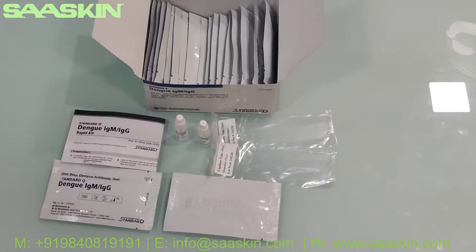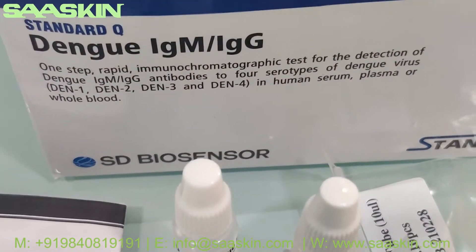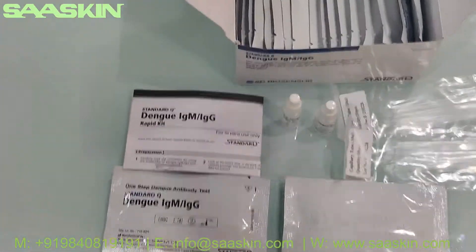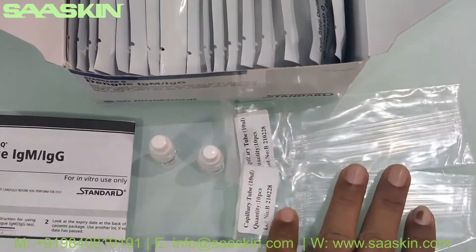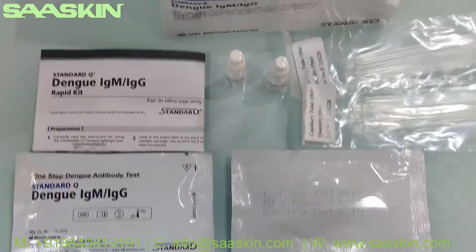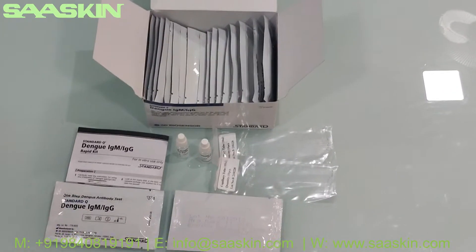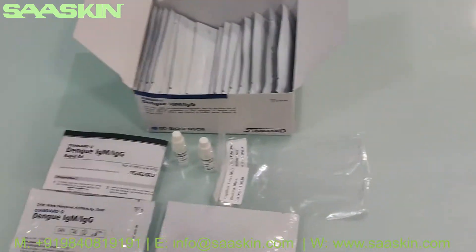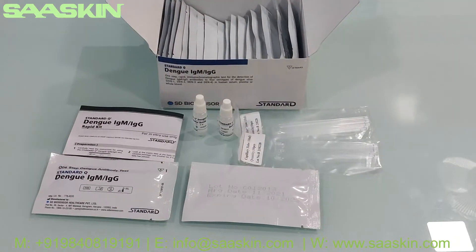Quickly to summarize: the Standard Q Dengue IgM IgG antibody test kit 20-test box contains one instruction for use manual, 20 specimen transfer devices, two bottles of buffer liquid, and 20 test cassettes. This is the complete unboxing of the kit. Thank you.